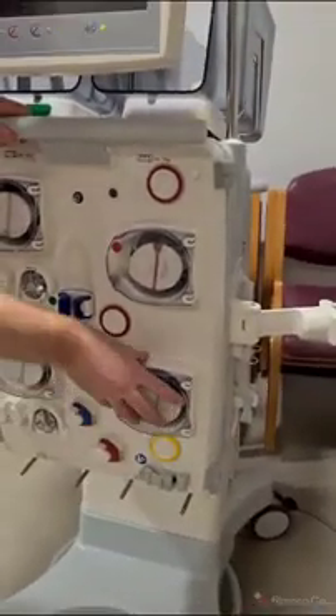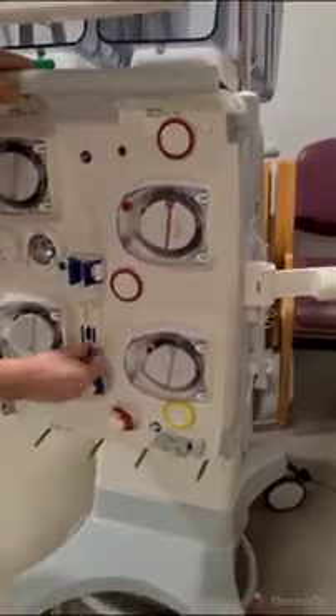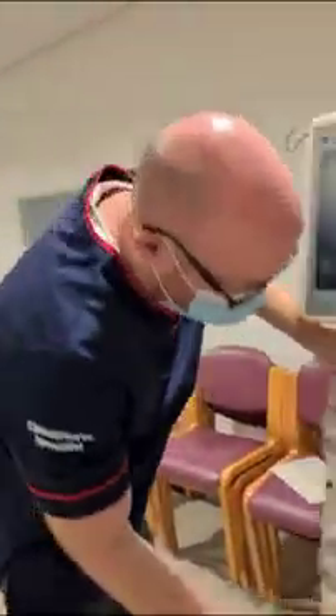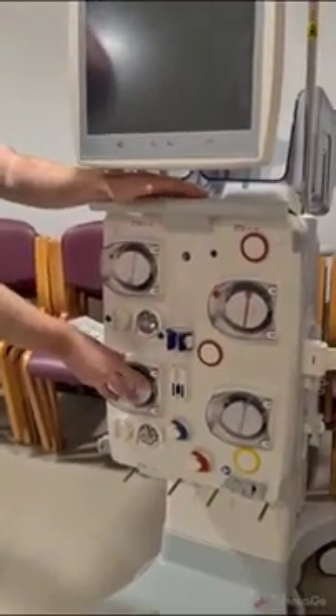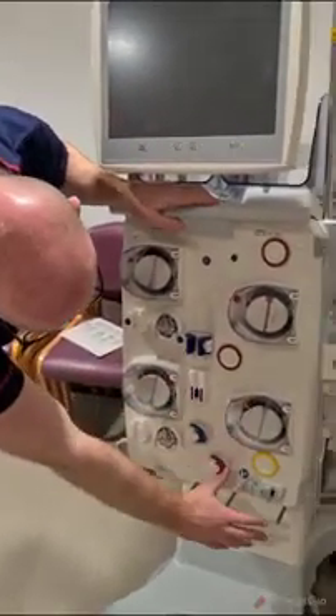Moving down, we have our filtrate pump, also called the waste pump. We have our optical detector here, which detects whether it's air, saline, blood — those types of things. This next pump we ignore because we're not using it with HD; we use that with different modalities, so we ignore that.